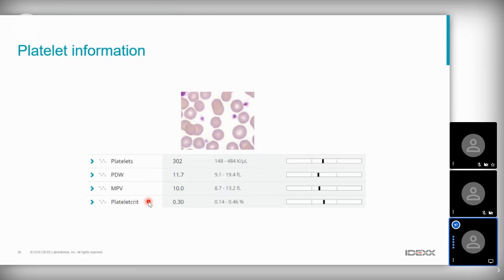They clump together, as I explained in the previous slides, and then they behave differently because if 50 platelets clump together, the analyzer may count it as one, and that can lead to pseudo counting of the platelets. That is why we have other factors like PDW, MPV, and PCT available. These are just like the RBC picture, like RDW, MCV, and HCT.